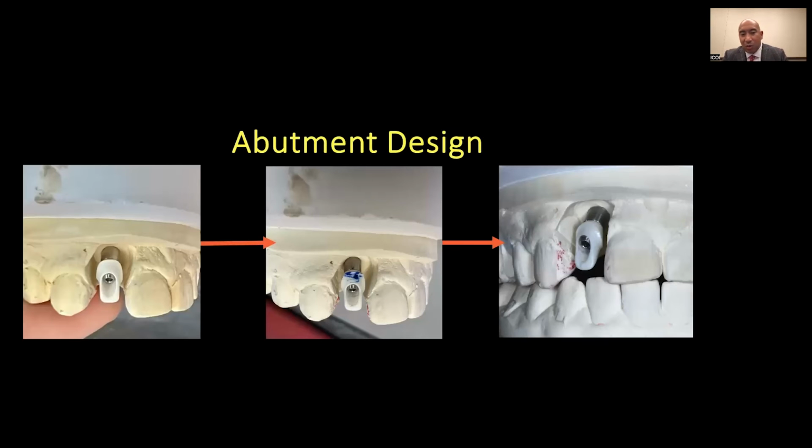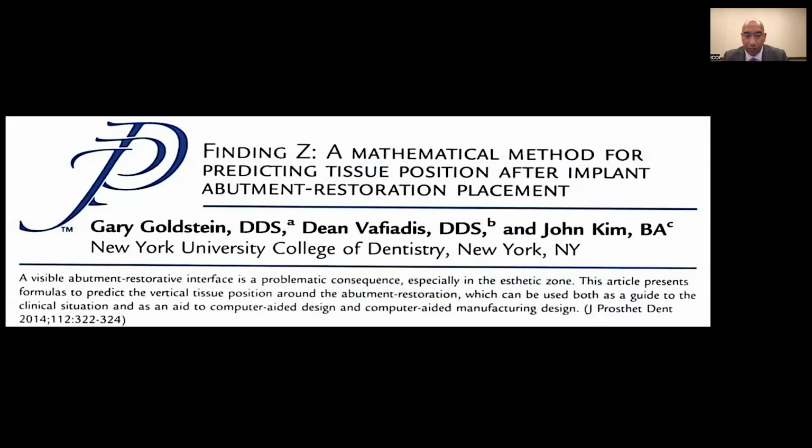So one of the things we did is we worked with the lab, and this was the abutment design that they had for her. And those blue marks are from me and my Sharpie. I just told the lab technician, wherever I mark it, just shave it all down. You want that facial surface as flat and concave as possible. I can't state that enough.